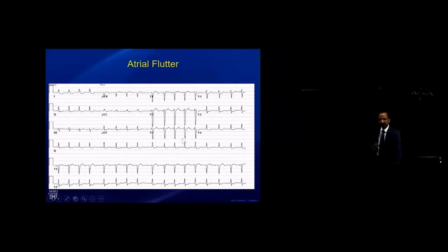This is the type of ECG that today we call flutter or macro reentrant atrial tachycardia. It's completely unpredictable what the P wave axis, flutter wave axis, duration of the flutter wave will be. What is predictable is many of these patients will have structural heart disease, prior surgery, and the vast majority will be in the context of ablating fibrillation or post-AFib ablation flutters. This is really today the flutters that we deal with.